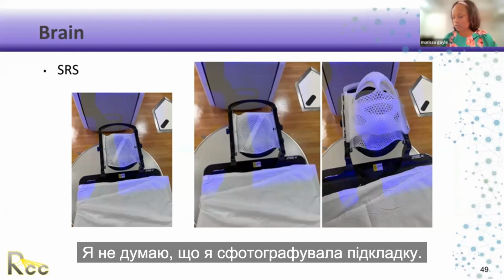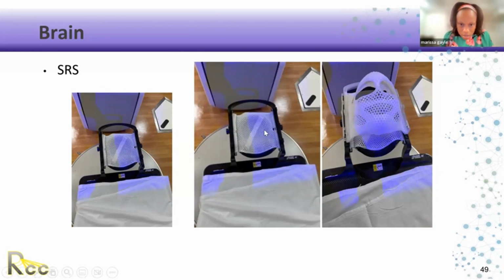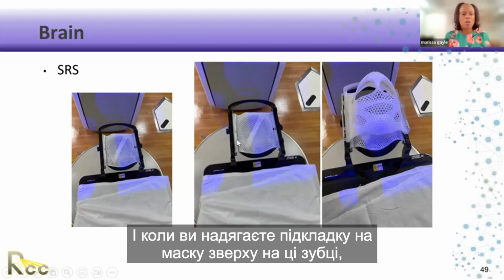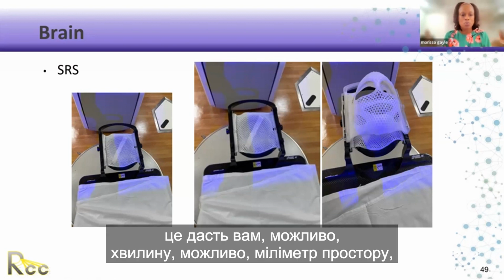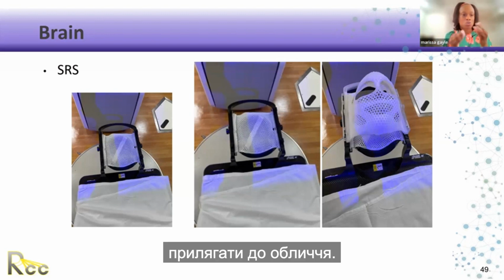I don't think I took a picture of a shim. If you look here in this mask, there are little prongs. I'm trying to show you here. And you would put the shim on top of that prong. So when you put the mask on top, it'll give you maybe a millimeter of space, but that millimeter will make a big difference when the mask is super tight.